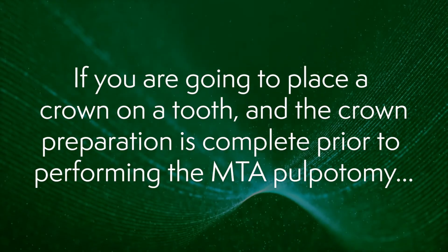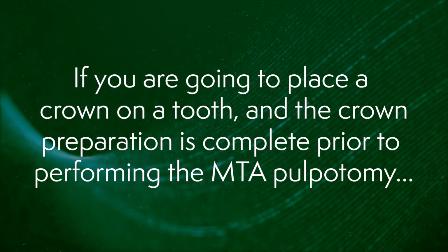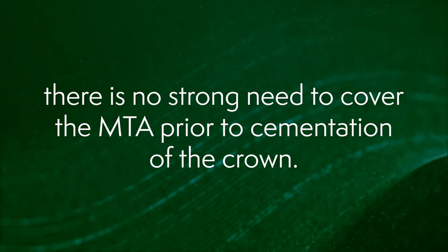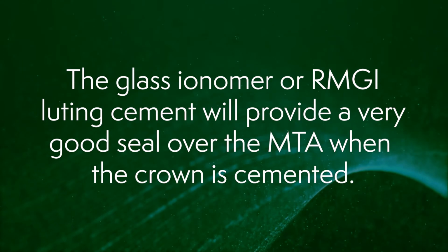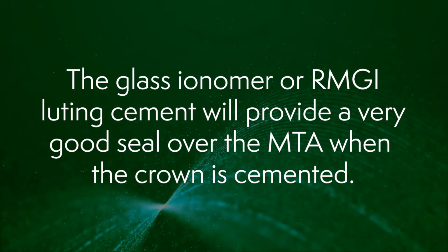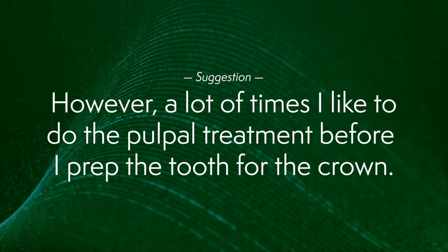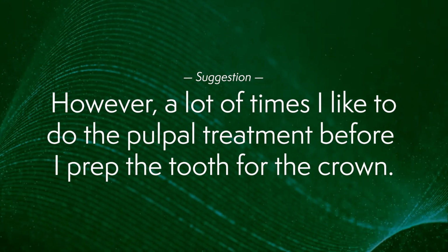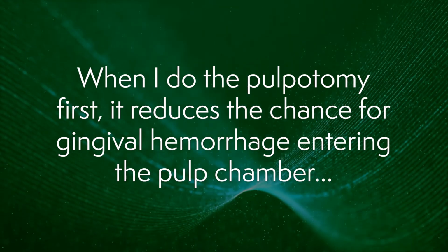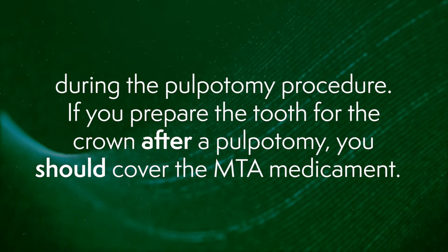If you're going to place a crown on a tooth and the crown preparation is complete prior to performing the MTA pulpotomy, then there's no strong need to cover the MTA prior to cementation of the crown. The glass ionomer or the resin-modified glass ionomer luting cement will provide a very good seal over the MTA when the crown is cemented. However, a lot of times I like to do the pulp treatment before I prep the tooth for the crown. When I do the pulpotomy first, it reduces the chance for gingival hemorrhage entering the pulp chamber during the pulpotomy procedure.